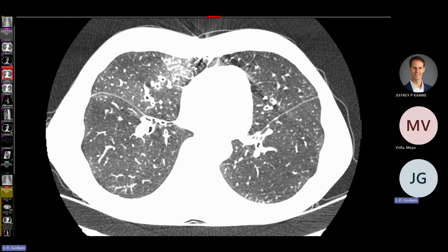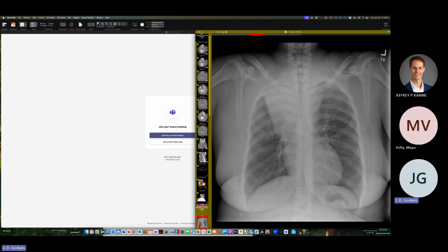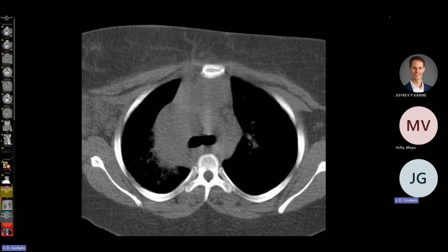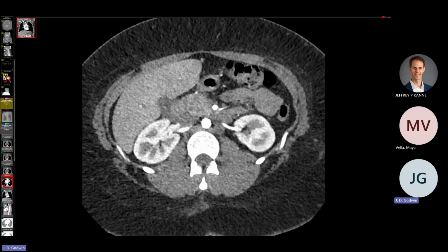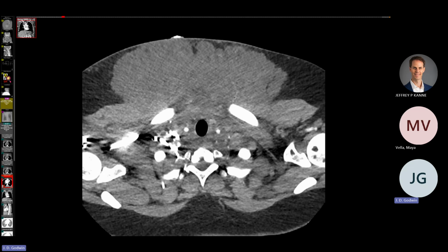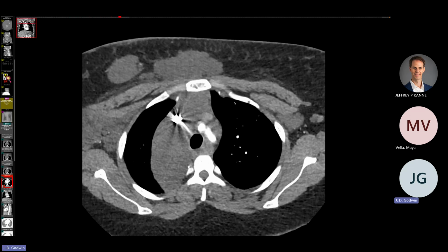It was Seth who presented, I think, this case of PAMS with thymoma. So I wanted to bring those two cases up from the past. And then this person has this upper mediastinal abnormality, also has a lot of fullness here in the neck tissue. And on CT, you can see that there is a very extensive mediastinal mass, and there's also this anterior chest wall big lesion as well.